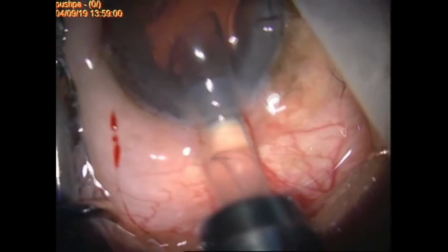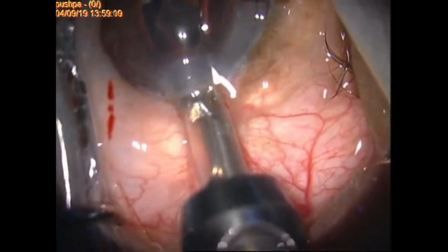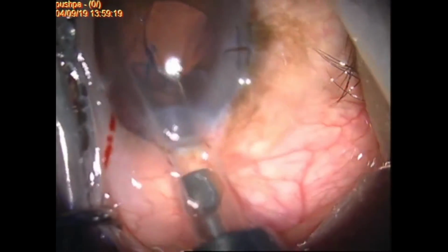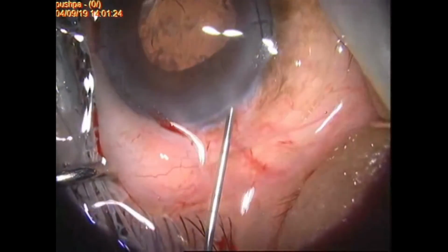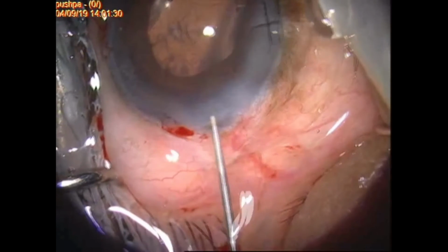Then, a 3-piece lens was placed in the bag. The most important point for IOL placement here was the haptics of the IOL were consciously placed away from the three radial tears. This animation module reveals the mental mapping strategy and how the haptics were placed away from the equatorial tears.